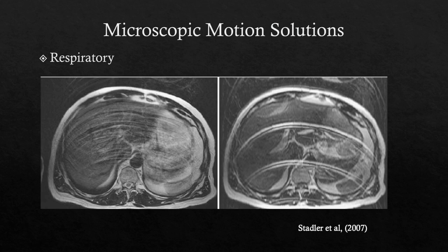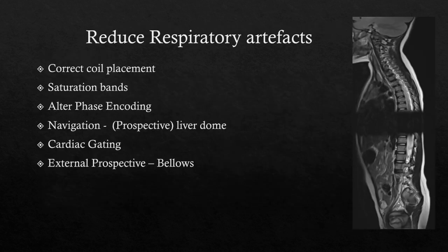This does have a time penalty, and especially for these type of scans, which a lot of the time are breath hold scans, that could be quite problematic for patient cooperation. So how can we tackle this? Some solutions to reduce respiratory artifacts.